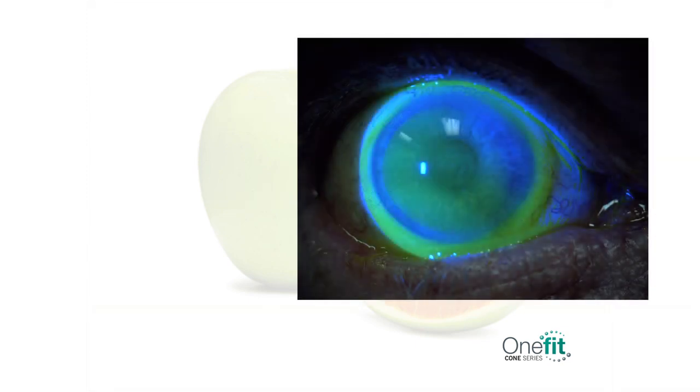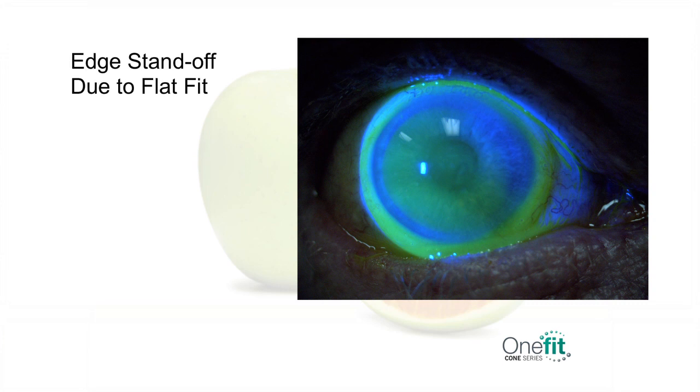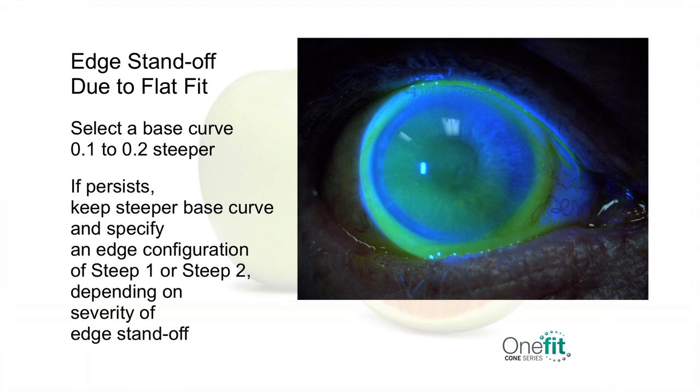If the lens is not comfortable, this could be caused by edge standoff from a flat fit. According to your evaluation of the central clearance, select a base curve that is 0.1 to 0.2 steeper as needed. If the symptoms persist, keeping the steeper base curve, specify an edge configuration that is steep 1 or steep 2 depending on the severity of the edge standoff.